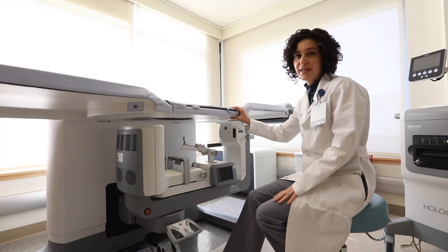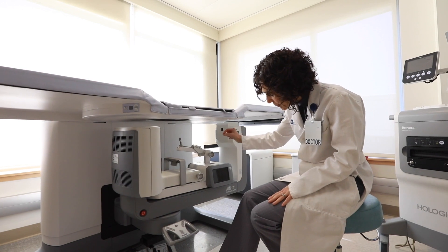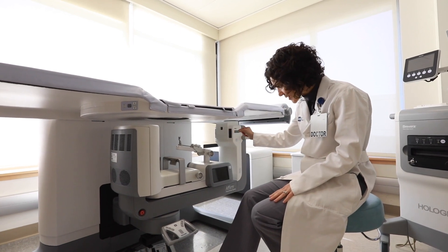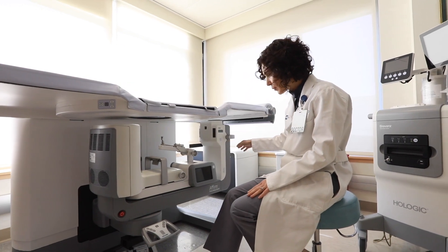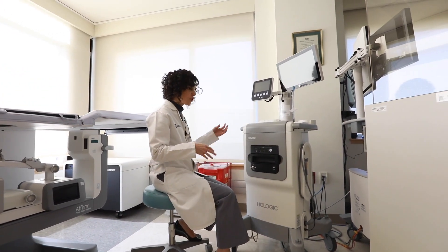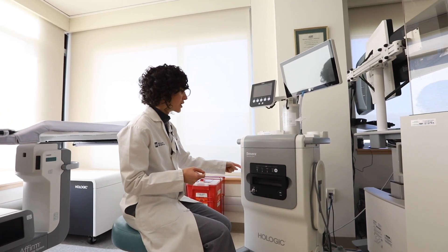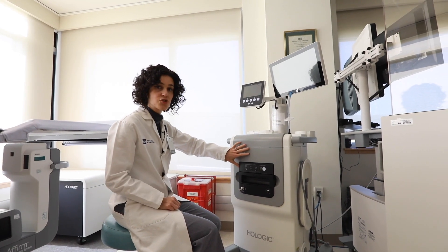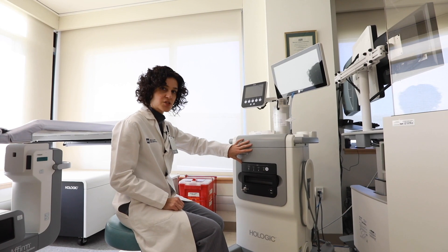This is the stereotactic table that the biopsy would be performed on. As we do the biopsy, every time we take a sample, the sample would travel through the tubing to this machine. This is a closed-circuit system, meaning no one is touching the specimen, and as the thread of tissue goes into the machine, inside here an x-ray would be taken to show whether or not the specimen we took contains calcifications.